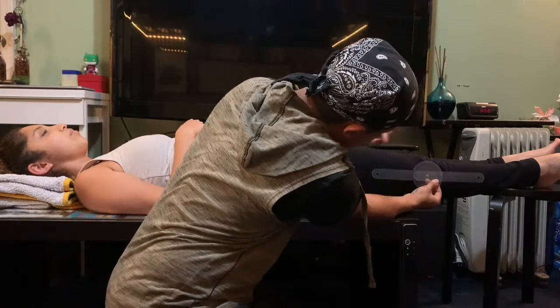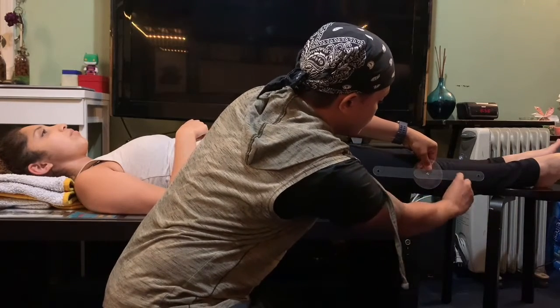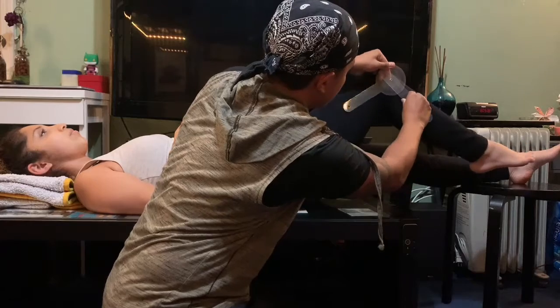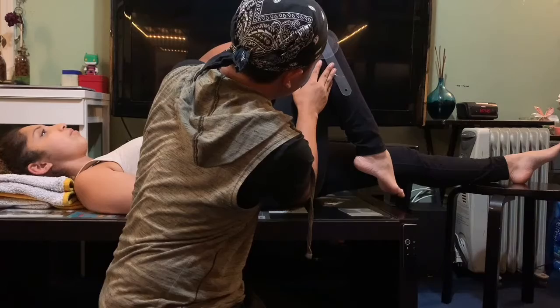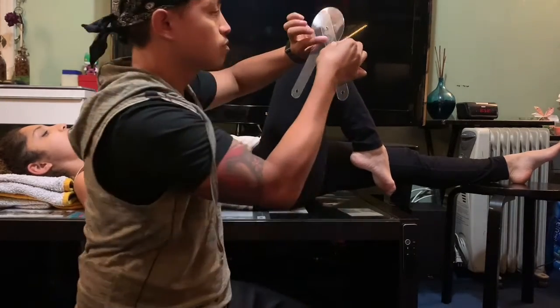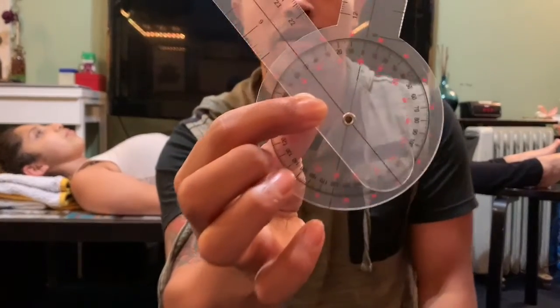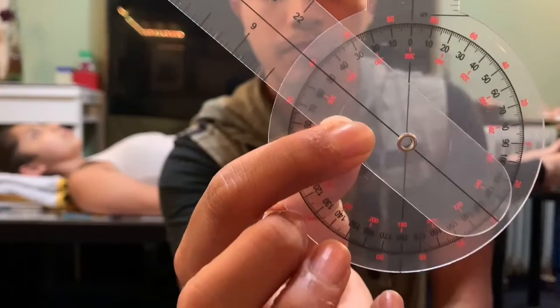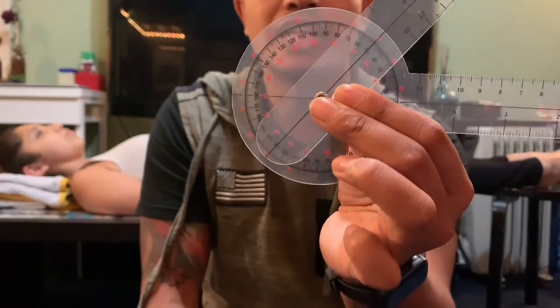We are going to start at 180 degrees and I'm going to follow her as she does the range of motion. Go ahead and flex your knee. We are at 50 degrees here. We started at 180 degrees, which means that her range of motion is 130 degrees.